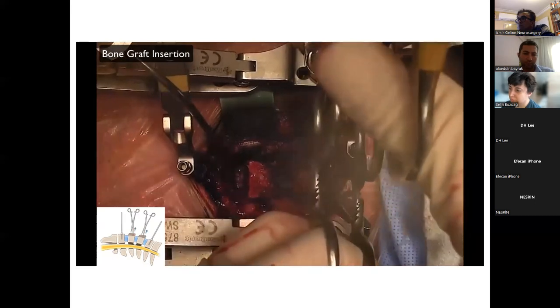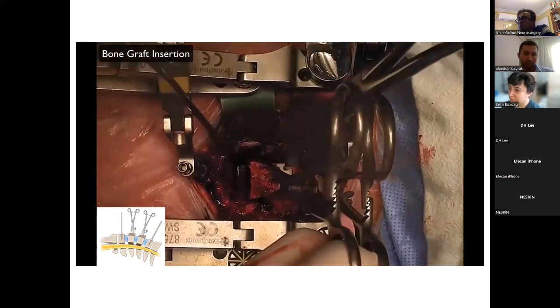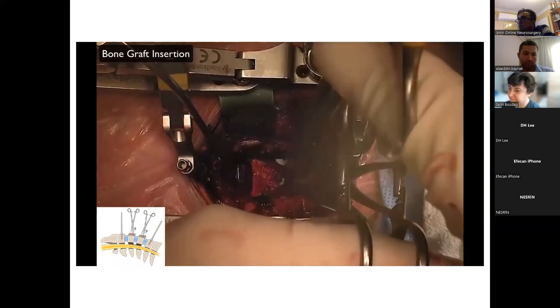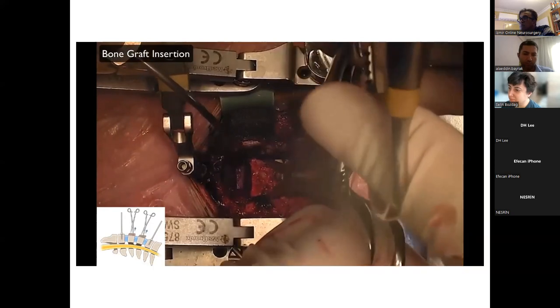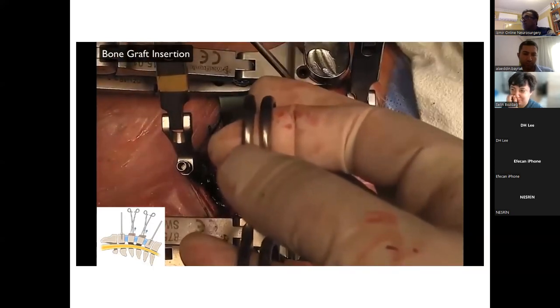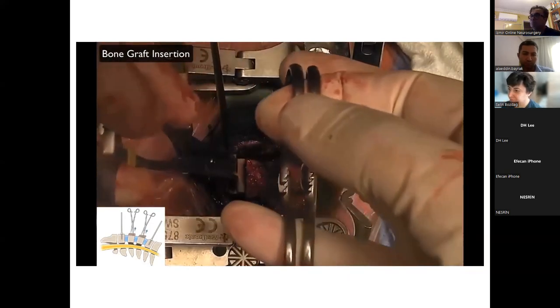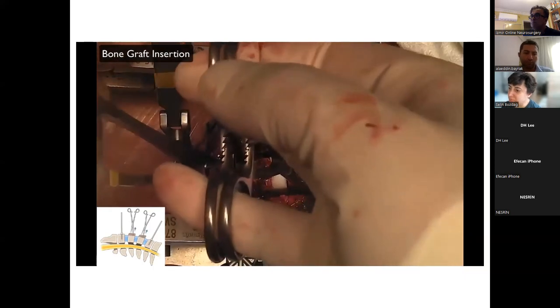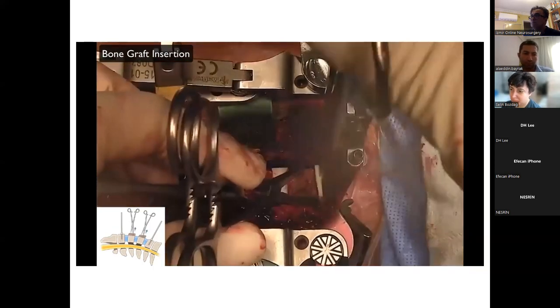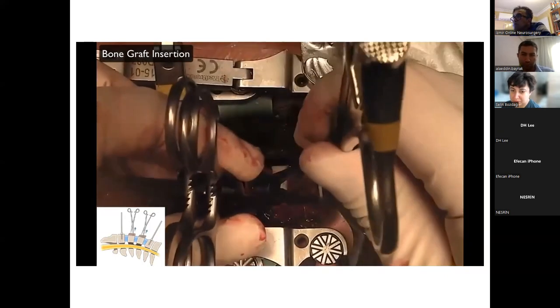After making the lateral slits, the vertebral bodies become movable, and they are grasped using Ellis forceps. By manipulating the Ellis forceps, surgeons can translate the vertebral body anteriorly by the desired amount. Interbody spacers are inserted while maintaining the vertebral bodies in the desired position.